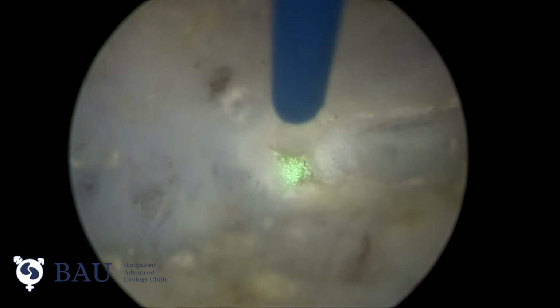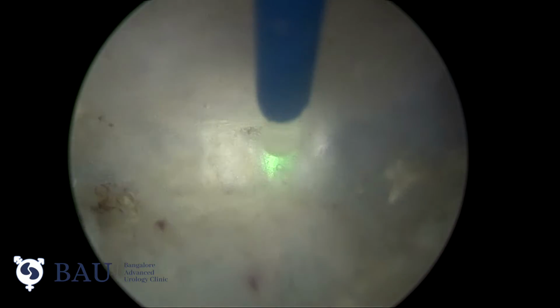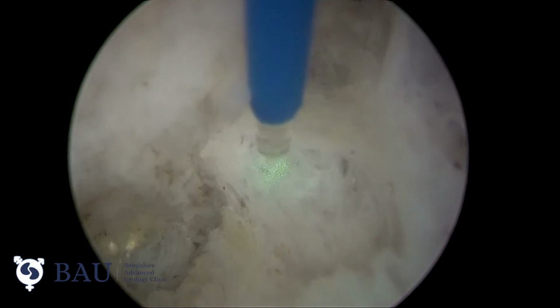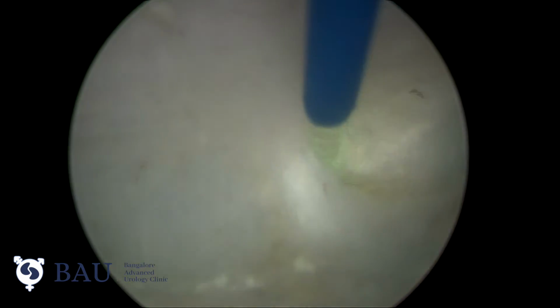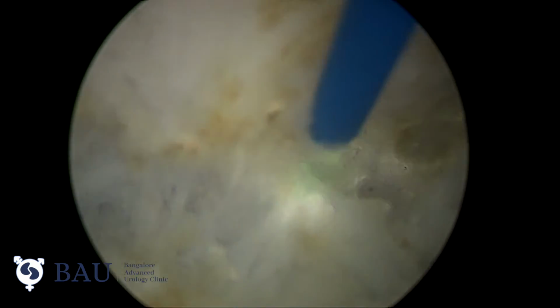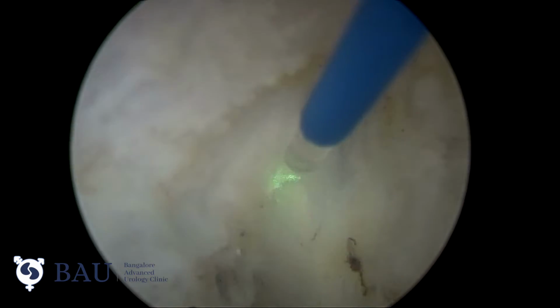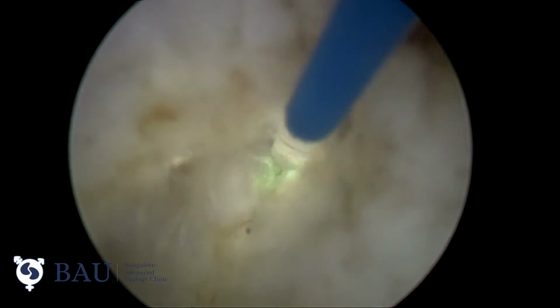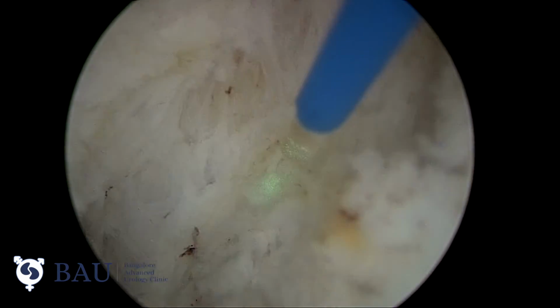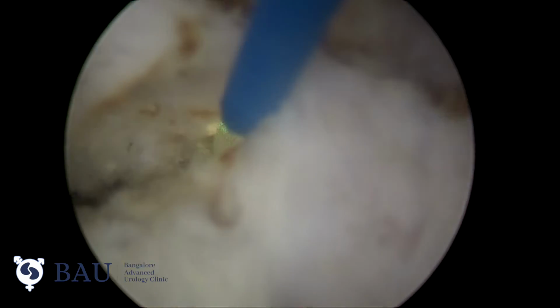As long as you are in a good plane, we just continue there with broader movements. As long as we are in the correct plane, the dissection will be smooth.